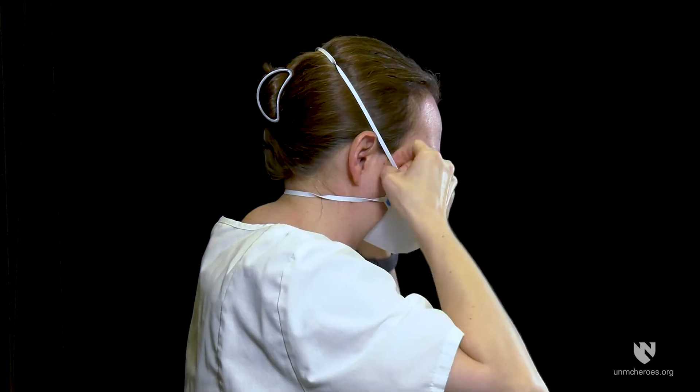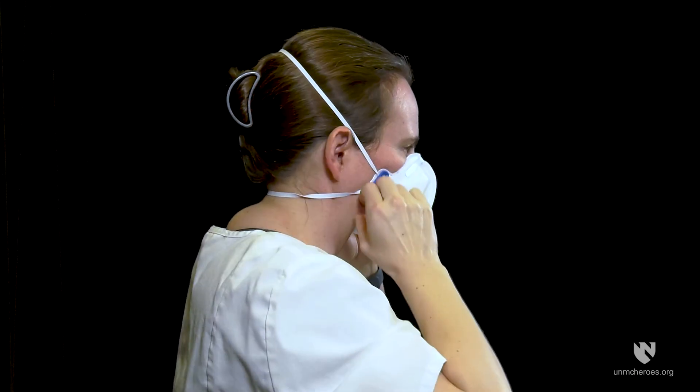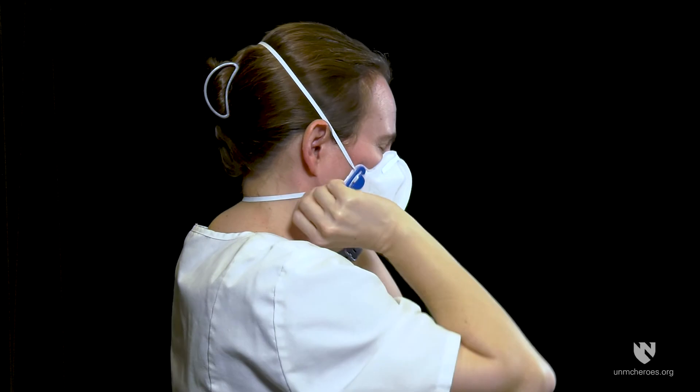Shape the nose clip to fit your nose, ensuring a good seal is created. Remove any twists in the head straps and adjust the mask to achieve a tight fit to your face.